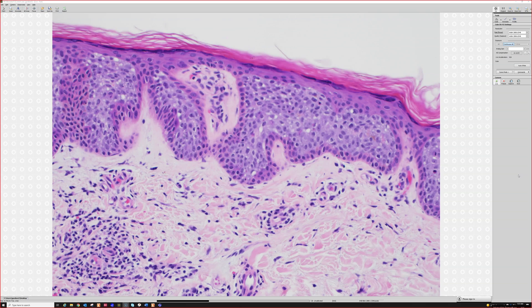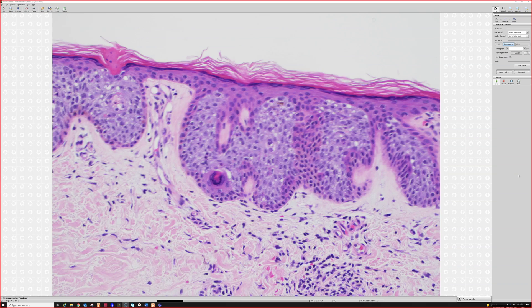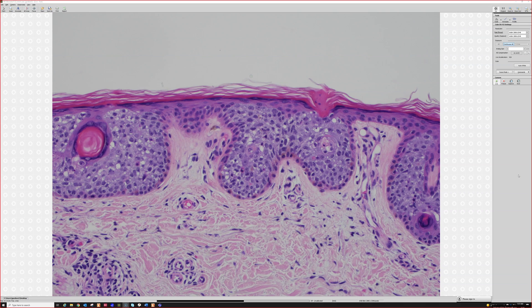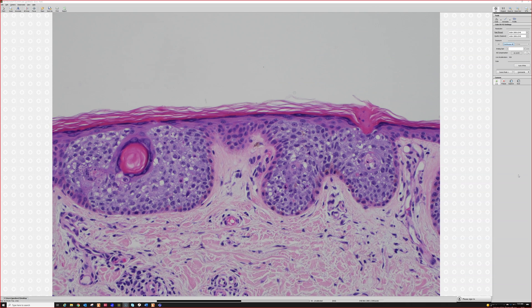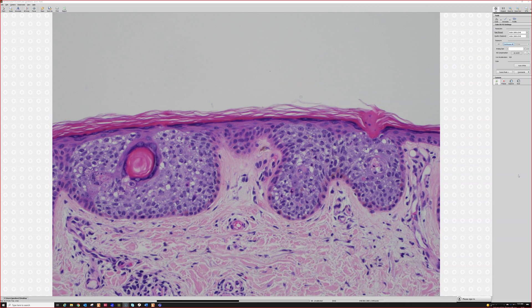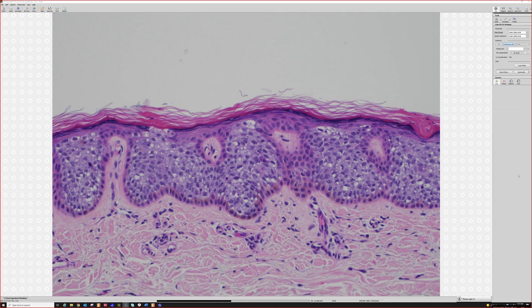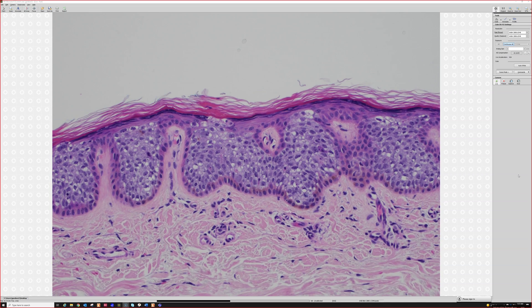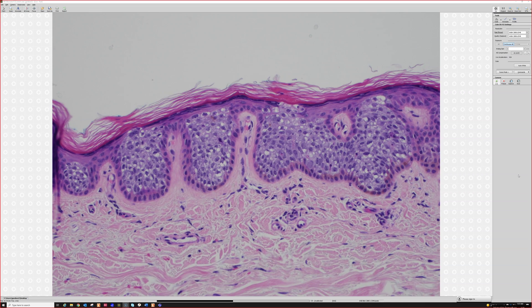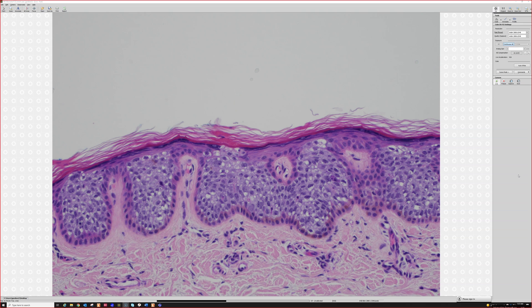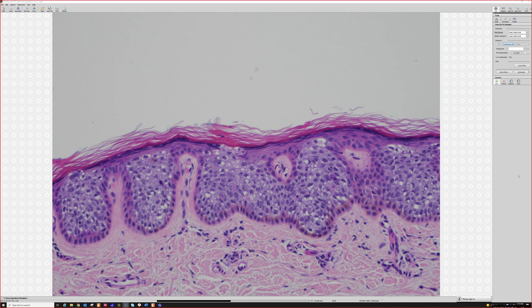This is actually one of the most perfect examples I see regularly. Look at that — this is Bowen's disease, squamous cell carcinoma in situ. This is a perfect example of the pagetoid form, or you could also say it has a clonal effect. From low power I would also really think of clonal seborrheic keratosis in my differential, because those can be thin acanthotic lesions that are thin and broad sometimes.